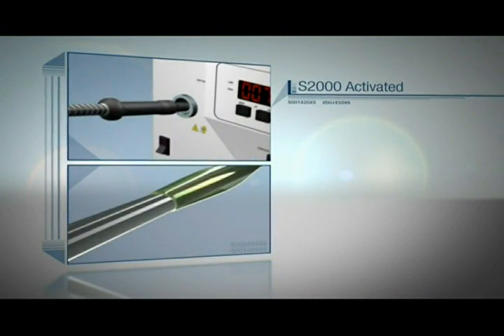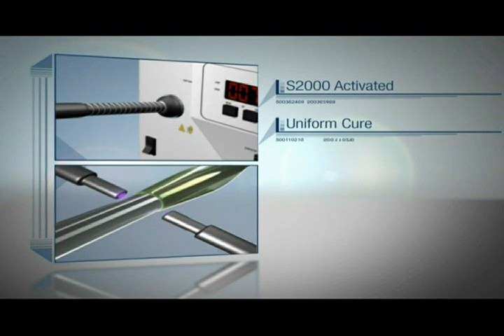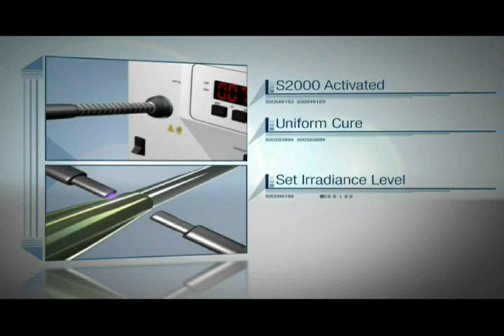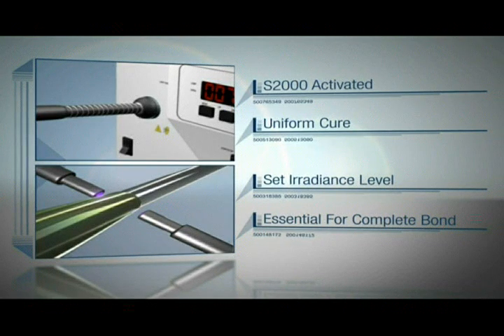The light is transmitted through the high power fiber light guide, providing a uniform cure around the catheter. While the Omnicure S2000 maintains the set irradiance level, uniform 360 degree illumination is essential to ensure a full and complete bond of the balloon to the catheter.